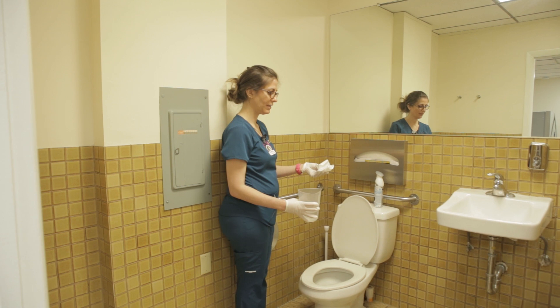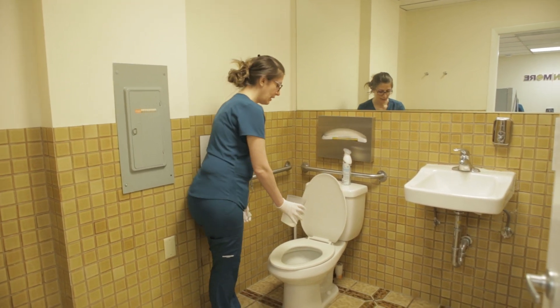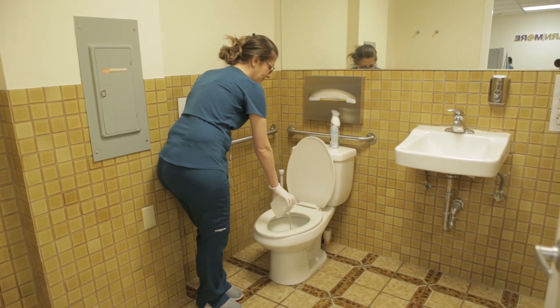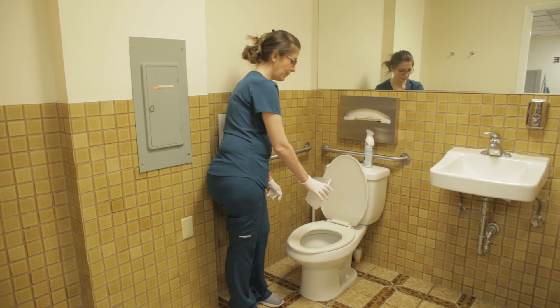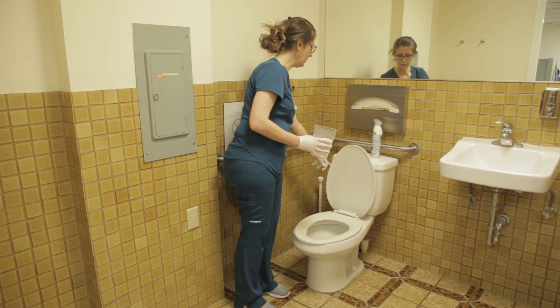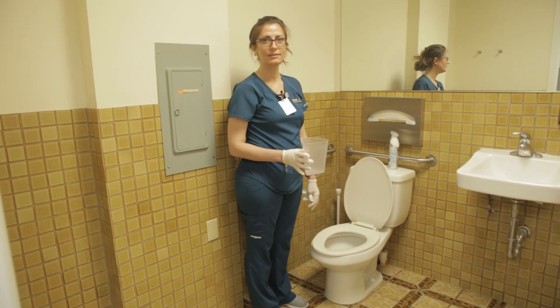Dispose of the paper towel barrier in the trash can, pour the contents of the graduated cylinder into the toilet, rinse out the graduate, and pour the rinse water into the toilet as well. Flush it down, then wash your hands.